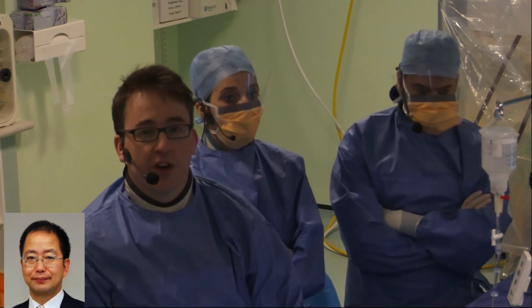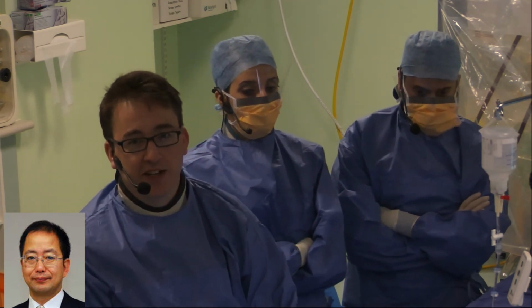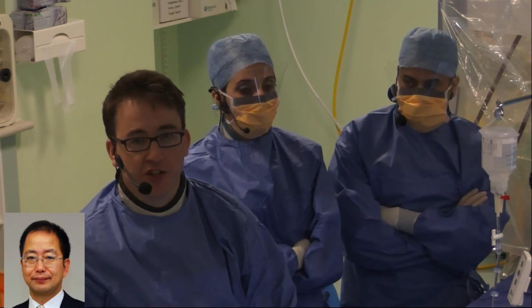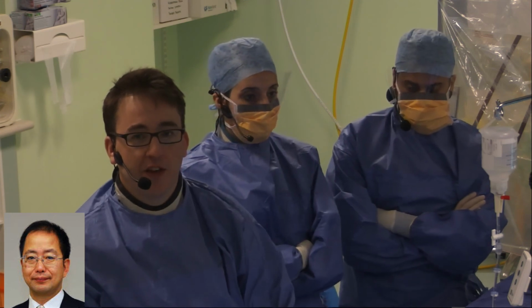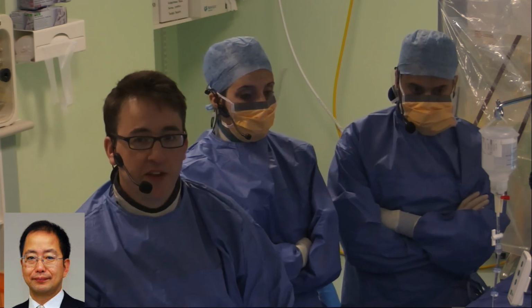Well, I can tell you that, and as you know, in the FLARE study which we're doing, and indeed any of the big studies, people have always been very, very careful with normalization. So whereas it's tempting clinically to try and speed through things, I think that we need to be absolutely careful to make sure we're getting the best possible physiology results.